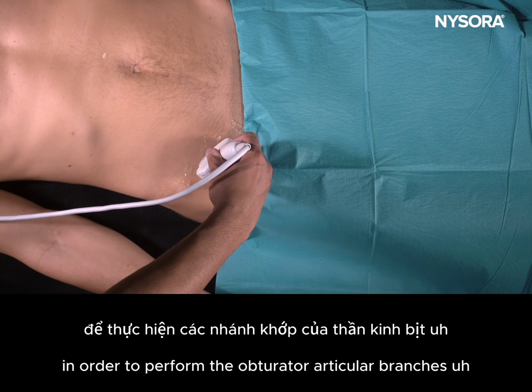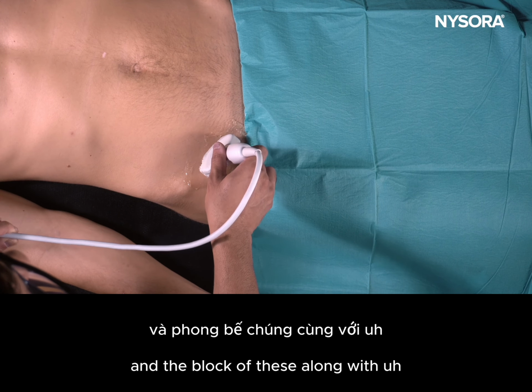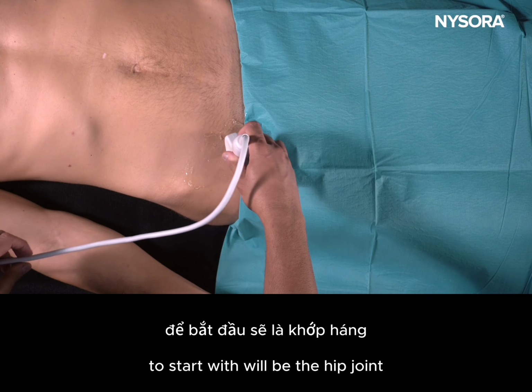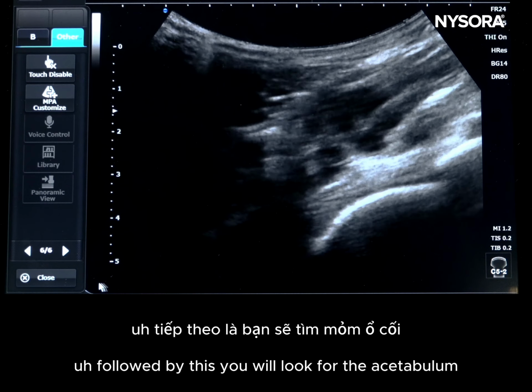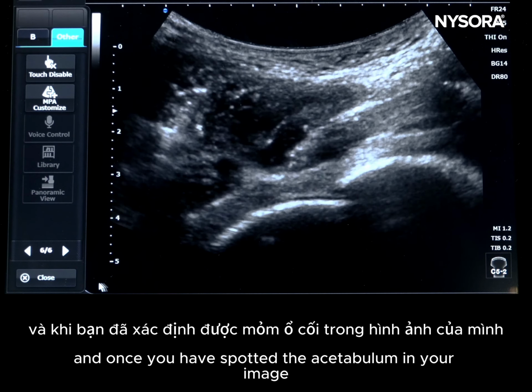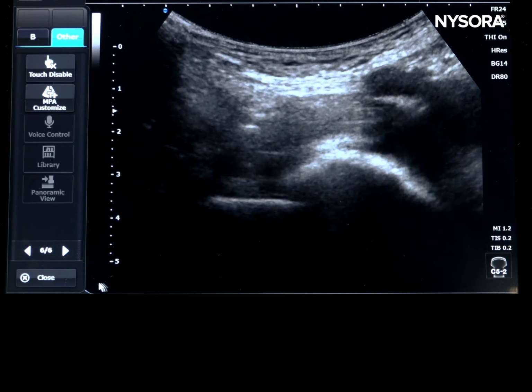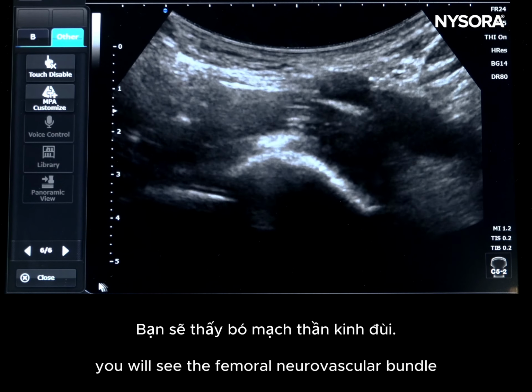In order to perform the obturator articular branch block along with the radiofrequency treatment, the structure that you would like to visualize to start with is the hip joint. Followed by this, you will look for the acetabulum, and once you have spotted the acetabulum in your image, you will then move the ultrasound probe, looking only at the acetabulum. Once it's in the middle of the picture, you will see the femoral neurovascular bundle.